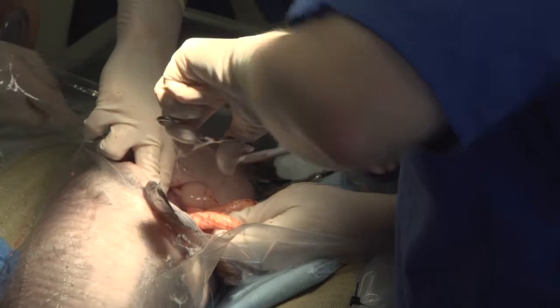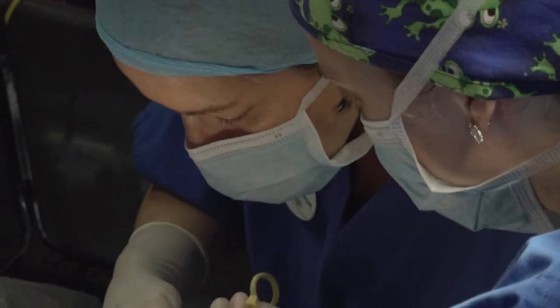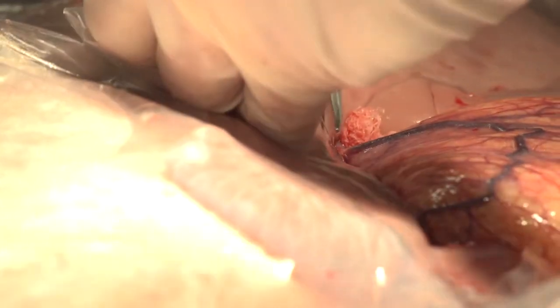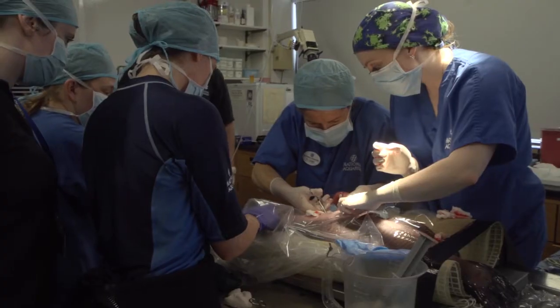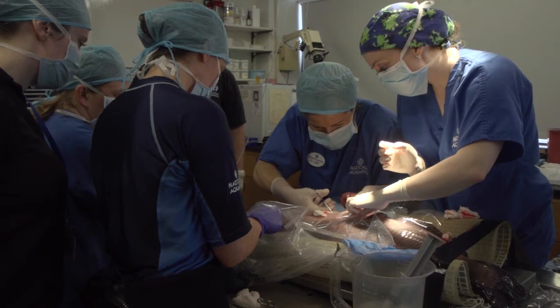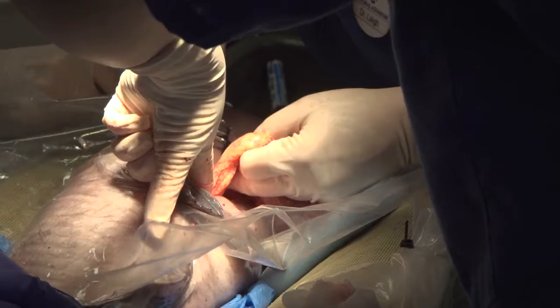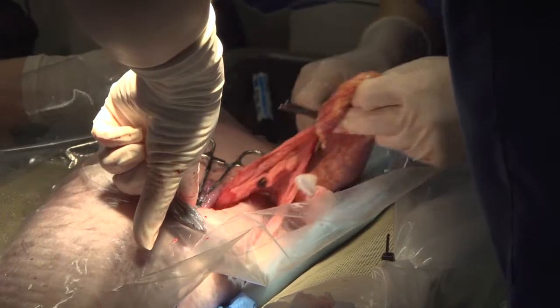It was a little bit tricky because her ovaries were very vascular, and so we had to tie off each and every blood vessel to prevent extra bleeding. Once we got through all of that, it was pretty straightforward to just tie off the rest of the actual ovary and remove it from her body cavity.